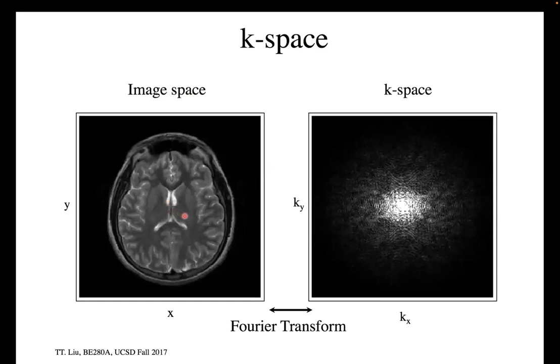And then there's two other species in the brain that are of interest. One is gray matter and white matter. And you can see that the white matter tracks in this brain down through here are darker than these gray matter volumes here. And then this white bright signal is sort of cerebral spinal fluid that is bathing the brain. So this is our set of magnetization vectors that we're imaging, or this is the final image.